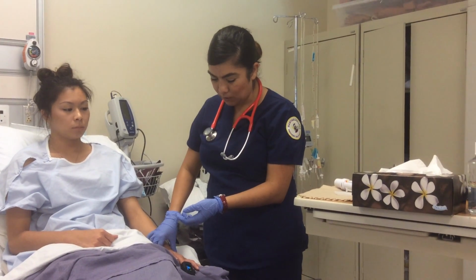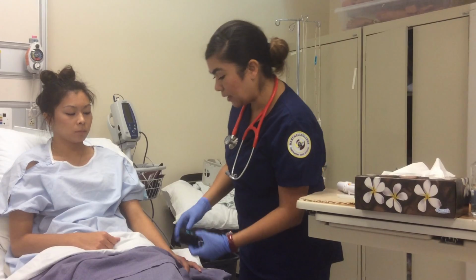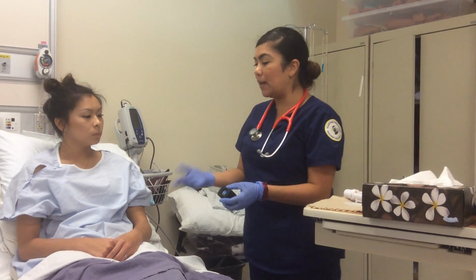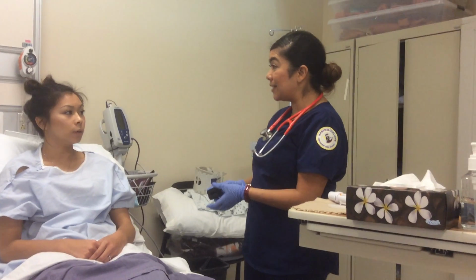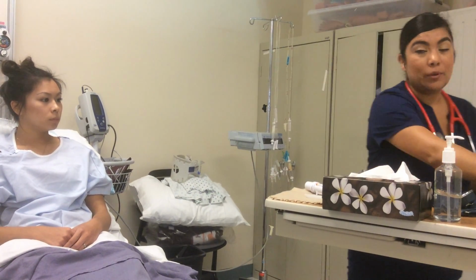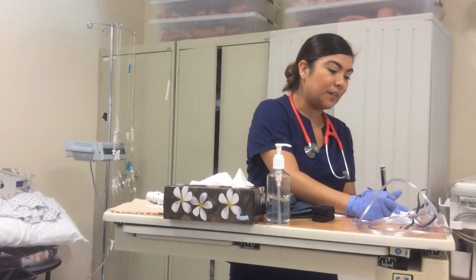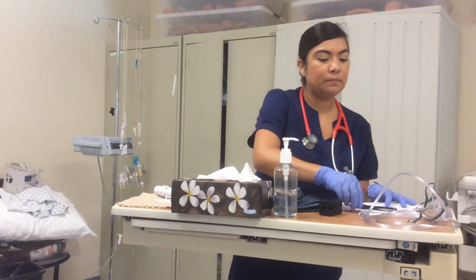And I'm going to take your heart rate. Okay, very good. Perfect. Very good. Okay, so you have 99% in your oxygen, so that's increasing, so that's good. Okay. And then your breathing this time around is at 16 breaths per minute. Okay, and then your pulse this time around was at 78, so there's a slight increase in everything, okay? So the medication must be working. Okay. Very good.